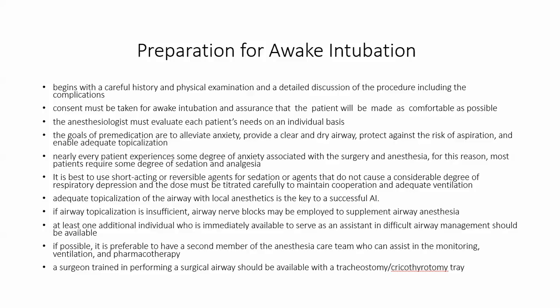Adequate topicalization of the airway with local anesthetic is the key to successful awake intubation. If airway topicalization is insufficient, airway nerve blocks may be employed to supplement the airway anesthesia.